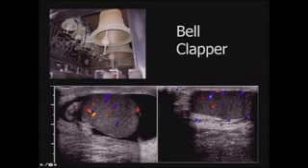In this particular case, the child was having intermittent scrotal pain. Certainly, this is a little bit of a funny-looking testis. It is enlarged and a little bit hypoechoic, perhaps, relative to the asymptomatic normal side. But at this point, the child was fairly pain-free. But with a very light touch and scanning around, you can tell that this is not a fixed testis. So this child most likely has intermittent torsion and detorsion, which we know occurs in approximately 50% of boys who ultimately present with testicular torsion. So look for that when you have the hydrocele fluid, because even though this child doesn't need surgery tonight, this child needs urologic consultation and orchidopexy.